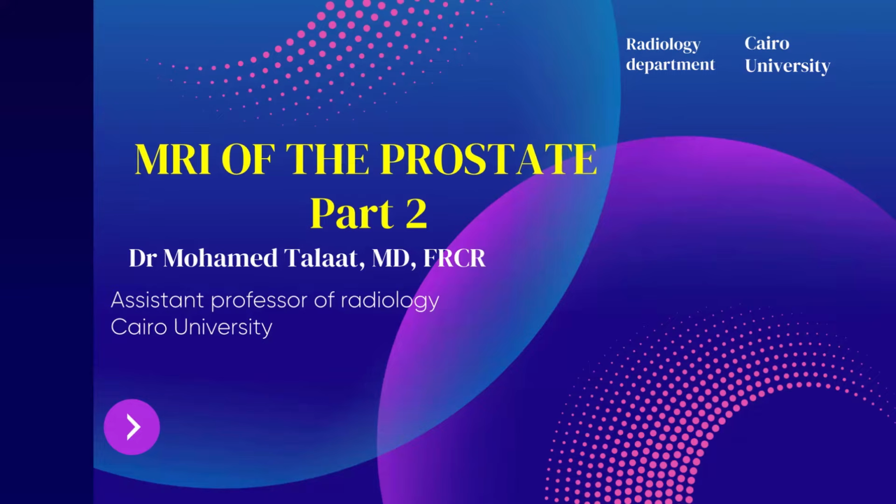Today, inshallah, we will talk about the second part, MRI of the prostate. Today, our objectives: we will discuss the detailed anatomy of the prostate and the segmentation model of the prostate.